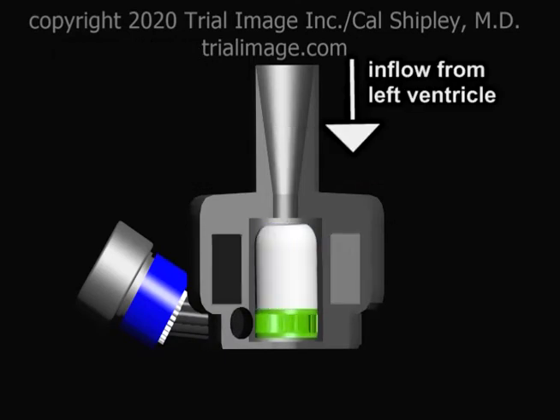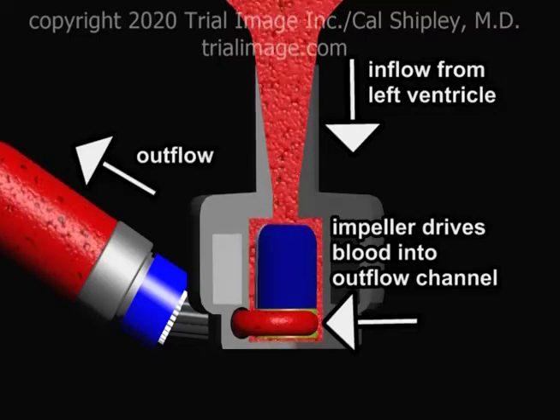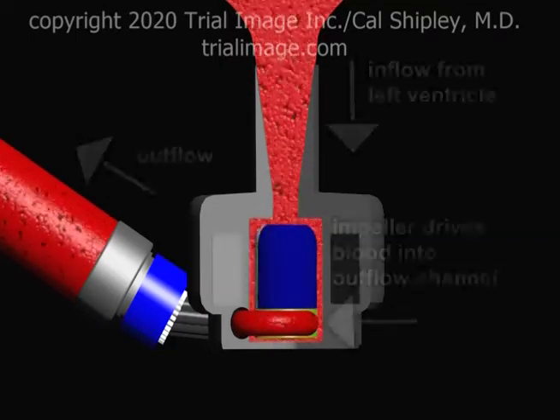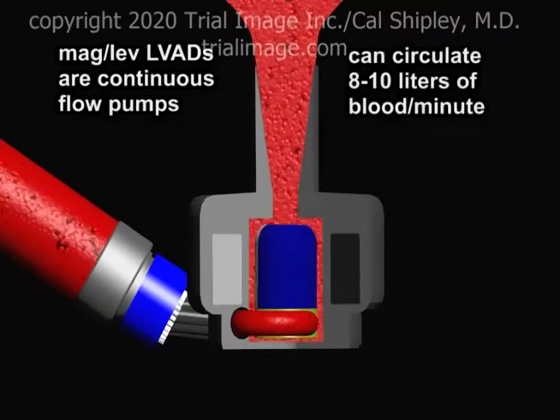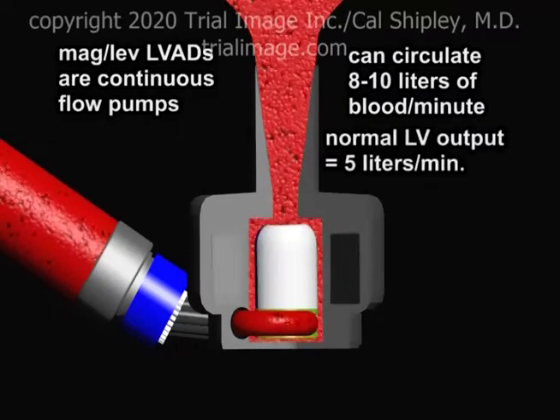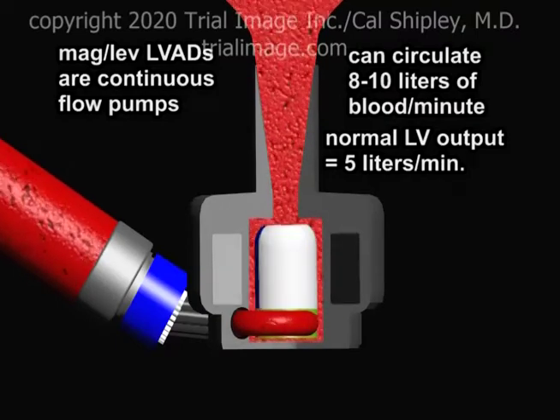Blood flows from the left ventricle into the pump through the inflow cannula and is then driven by the impeller into the outflow channel. Maglev-style LVADs are continuous flow pumps and are capable of circulating 8 to 10 liters of blood per minute. As a reference point, average cardiac output from the left ventricle in a healthy adult male is about 5 liters per minute.